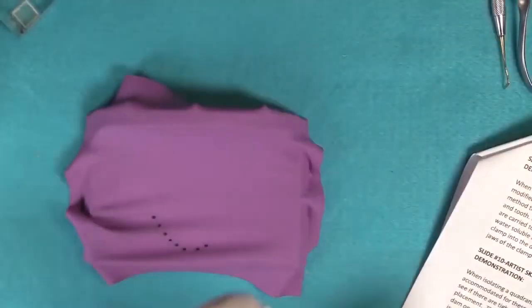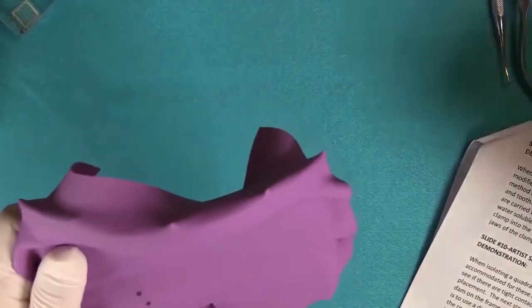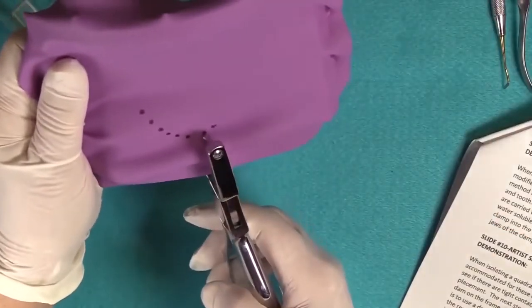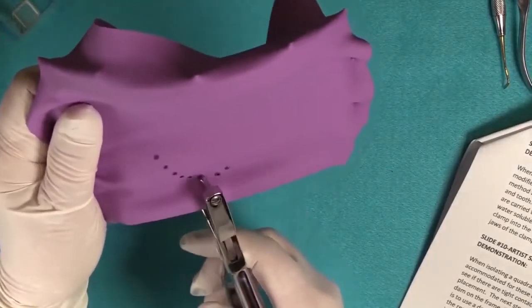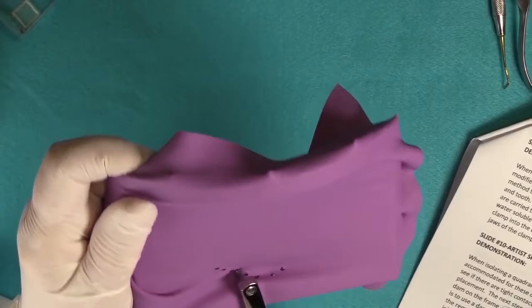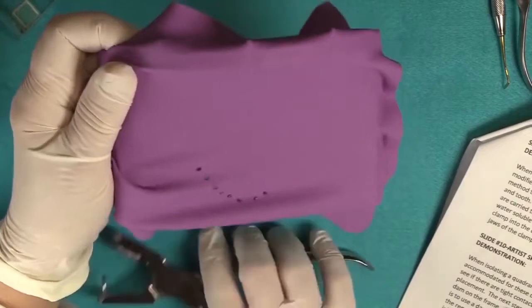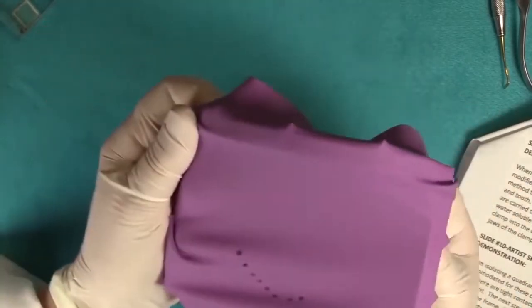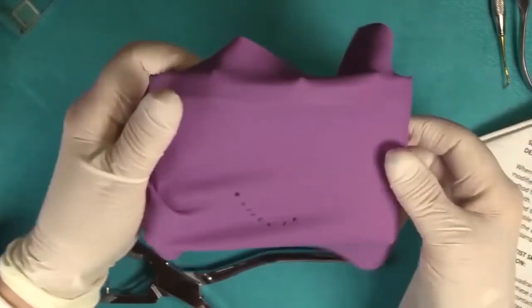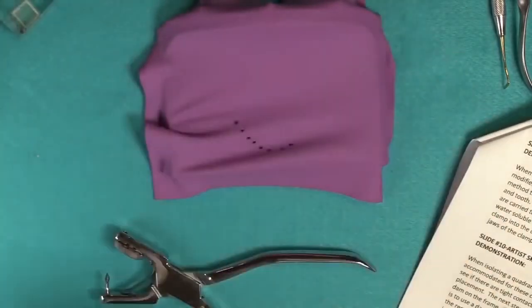Here we go. Okay, so we're going to take our punch, and again, we have the diagram up for your reference, and just simply go ahead and punch your holes appropriately for the hole sizes. Now, sometimes it depends on the size of the teeth, but sometimes you may have to go a whole size smaller when you're using a non-latex dam because the material stretch is a little bit more so than your latex product.